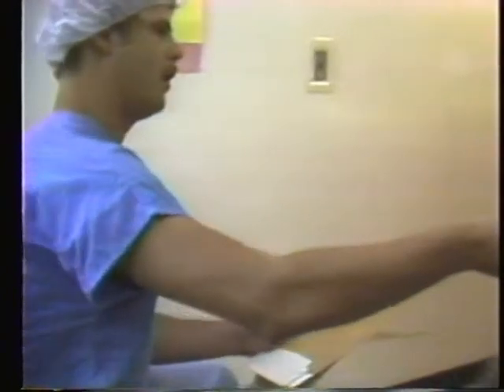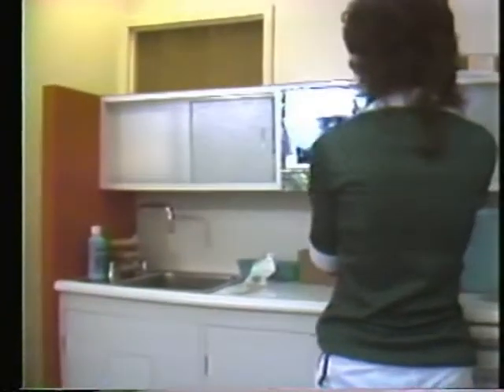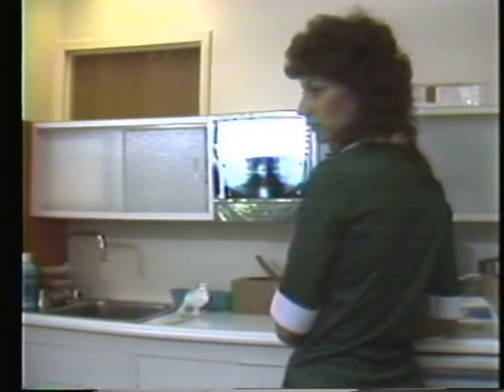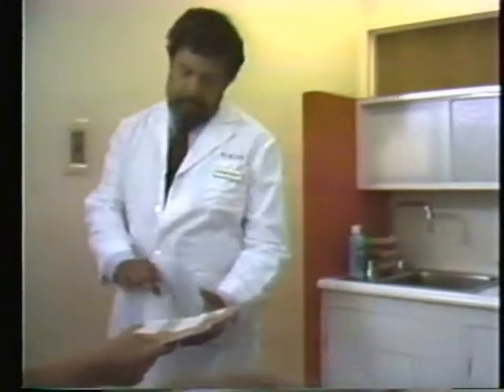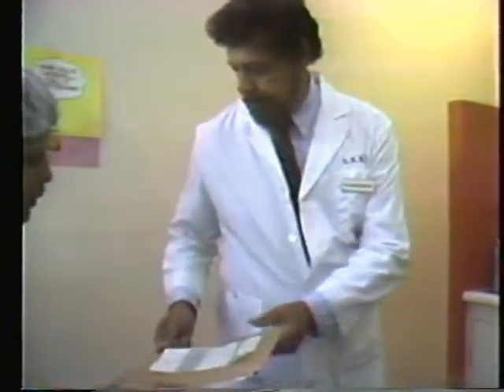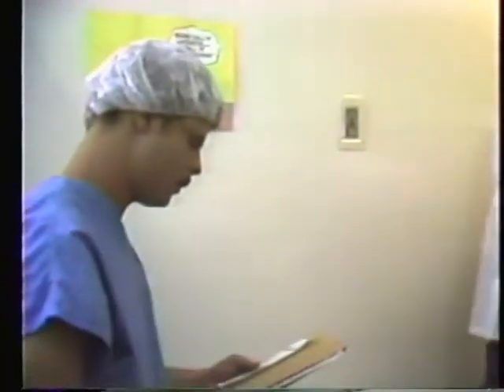Here's the x-rays, Connie. Connie, I'm going to need to have Dr. Blaustein sign this before we can start. In case of an emergency, the dental assistants can get you anything you need or bring an attending staff member to you. They'll also make available to you the proper payment and procedure forms.